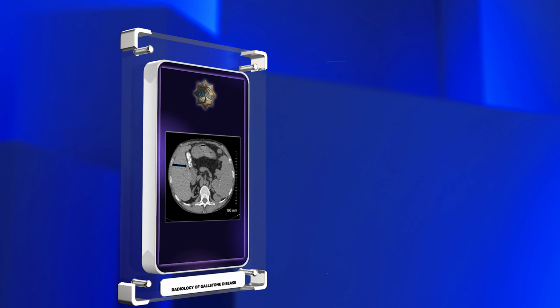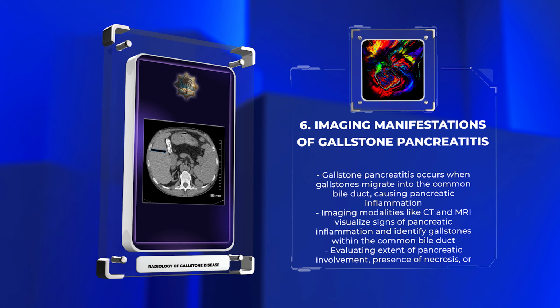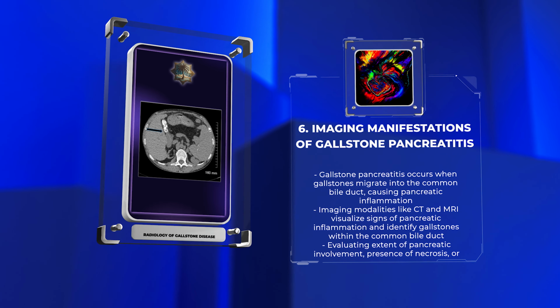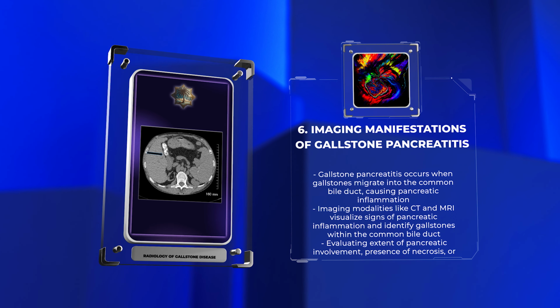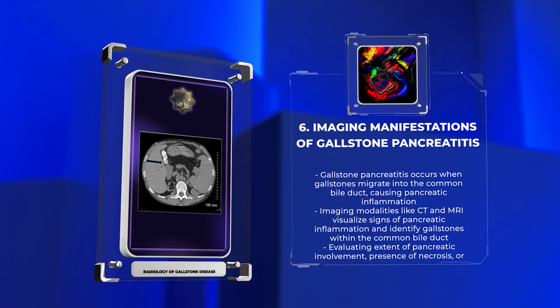Professor, gallstone pancreatitis occurs when gallstones migrate into the common bile duct and cause pancreatic inflammation. Accurate imaging evaluation is crucial for both diagnosis and determining the severity of disease. The professor shows a CT scan displaying pancreatic inflammation and gallstones within the common bile duct.